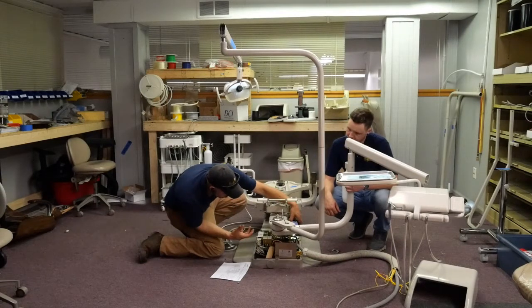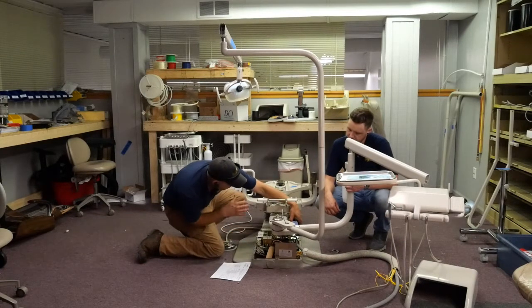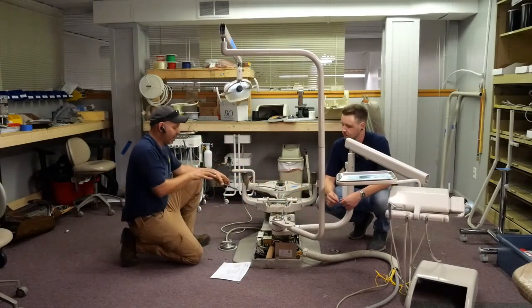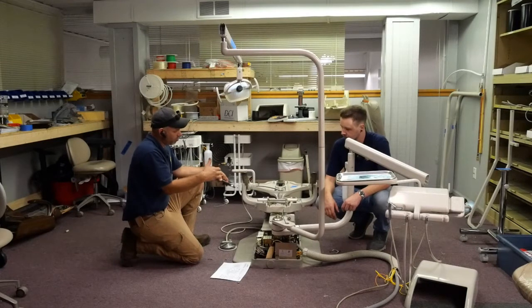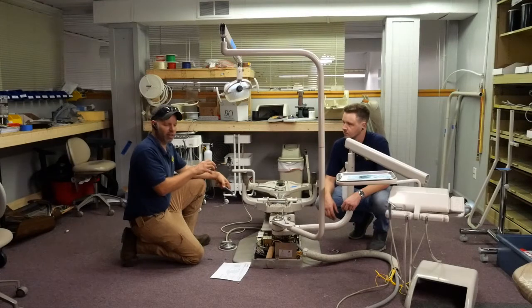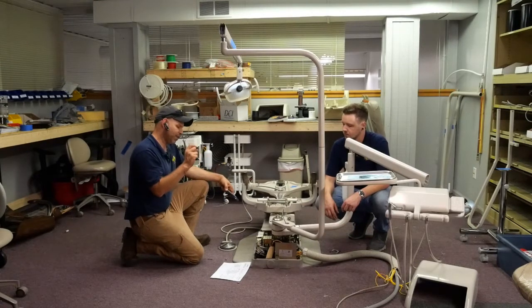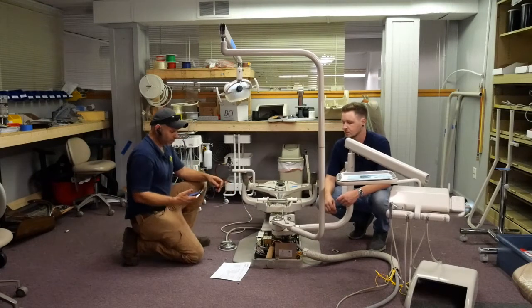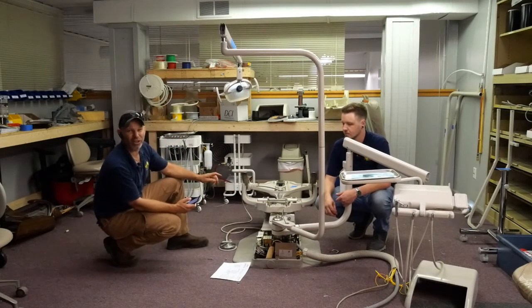And just know that in this situation where the oil is completely removed from the cylinders, there's not ever going to be any more oil than there is in the system right now. So when you're filling it, you want to fill it to about a half inch below the top of the reservoir. Now, there is specialty hydraulic fluid that can be bought that says dental chair oil.